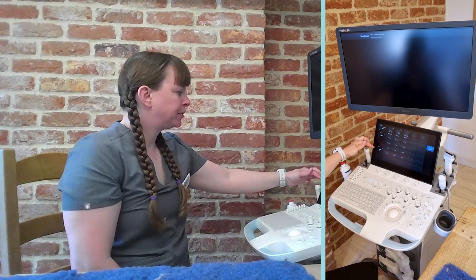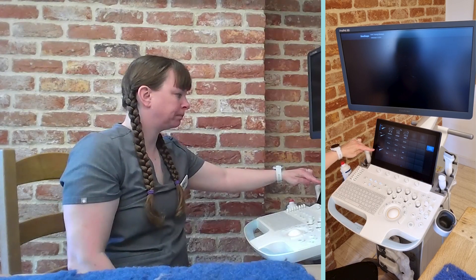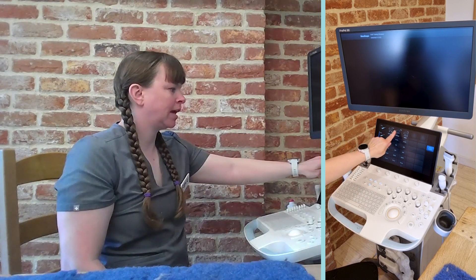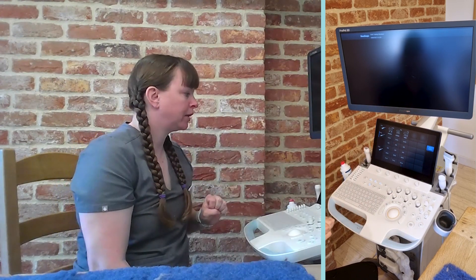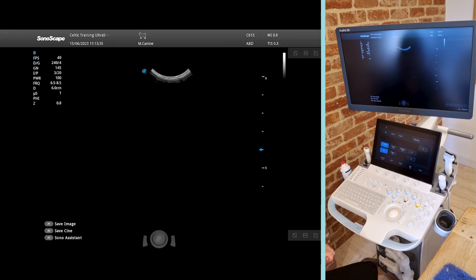Here we've got our Probes — this is the screen we get initially and we can choose from our available probes. I'm going to start by choosing our Microconvex Probe. We can look at the animal size options: cat, under 5kg dog, and 5–15kg dog. I'm going to choose abdomen on the 5–15kg dog, and then we can just start scanning straight away.